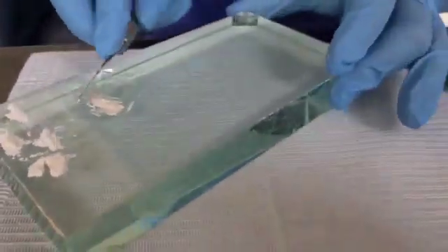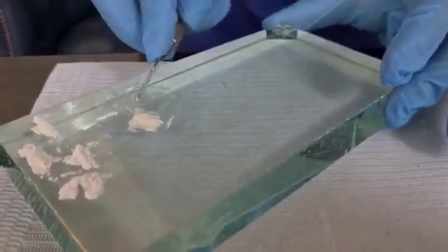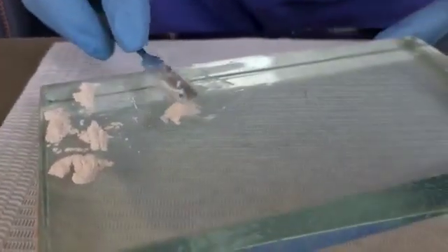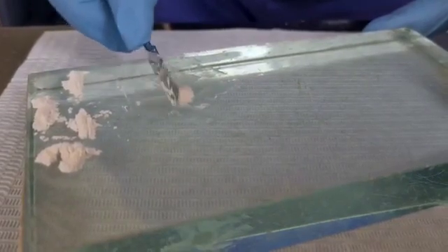This is the right consistency to pick up with the filler and then dress the tooth. But again, it depends on how dry and how thin a consistency the dentist prefers.